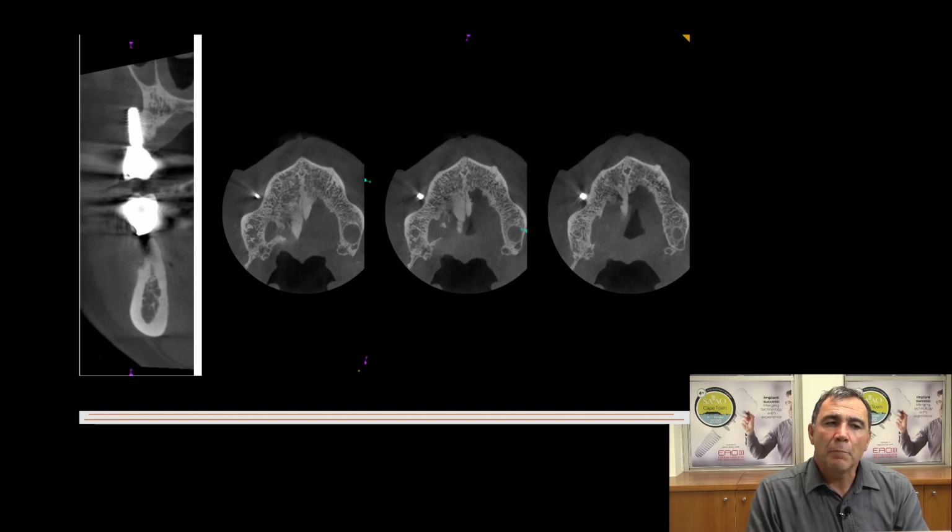I took out this implant and replaced it in the proper position, and I can say to you that the patient is quite happy at the moment. And even with this little amount of bone that is attached, the implant was fairly stable. It was easy to remove, but the patient could still function on this, but it was not ideal. Thus, I replaced the implant.